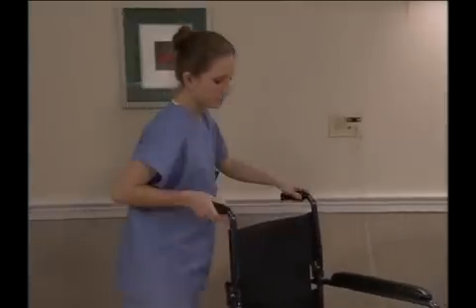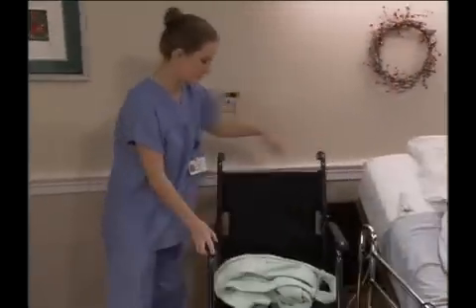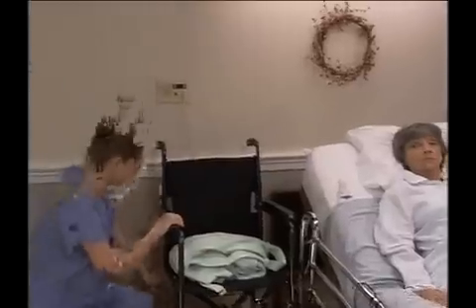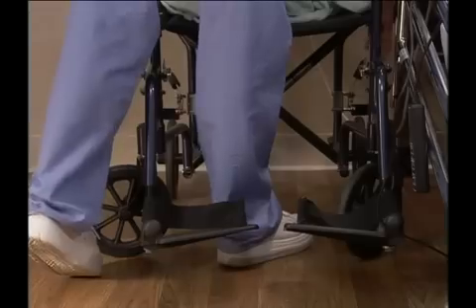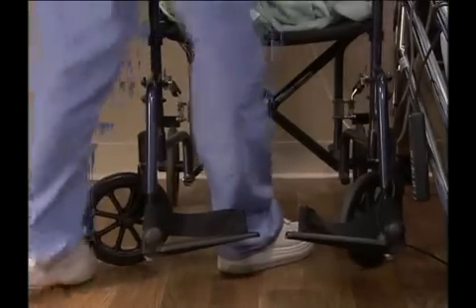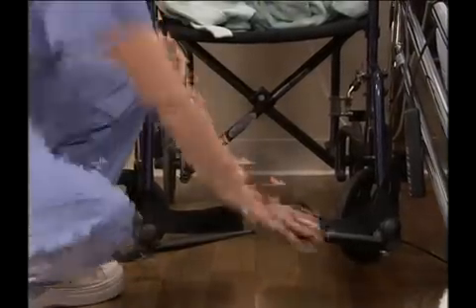Now position the wheelchair next to the bed, facing the foot of the bed. If possible, brace the wheelchair against a wall or solid piece of furniture to keep it in place. Lock its wheels and position the footrests out of the way.